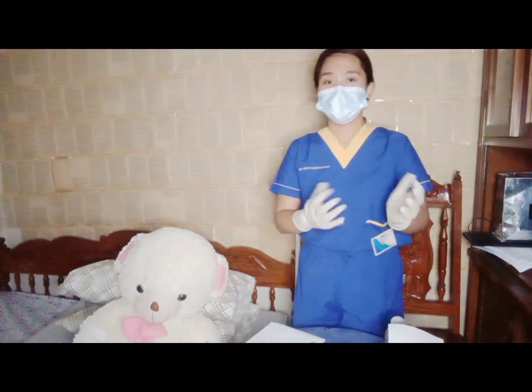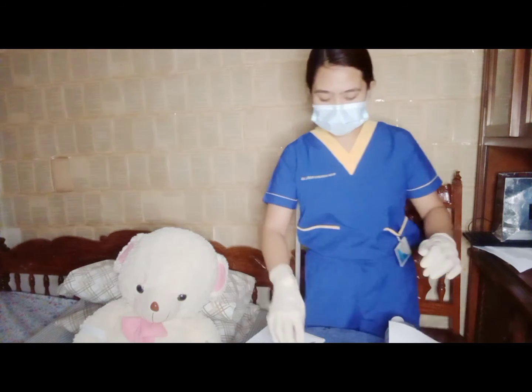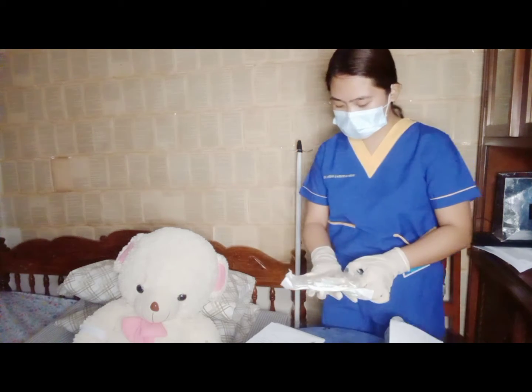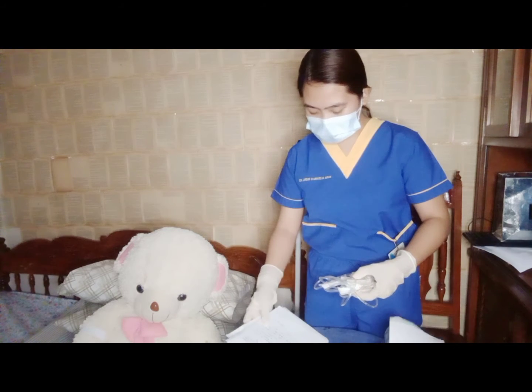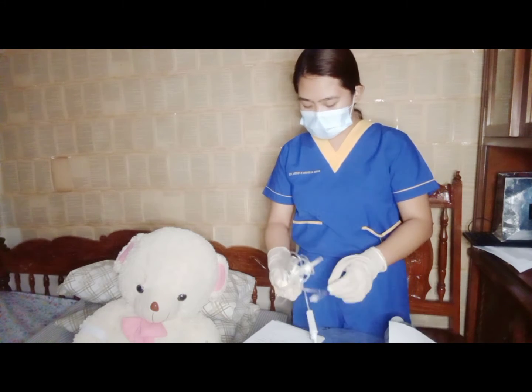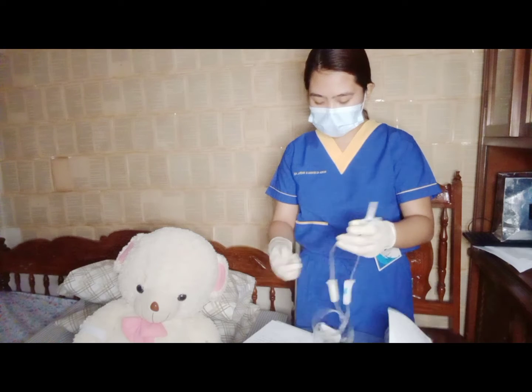Okay. Then, let's start the transfusion. Okay, so this is the blood transfusion set.